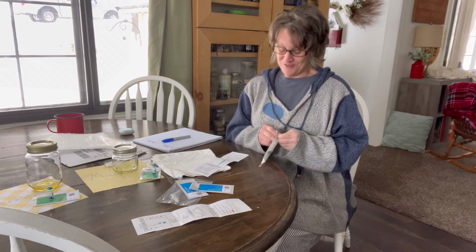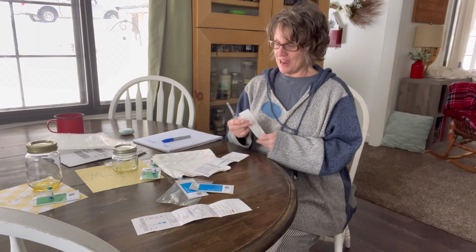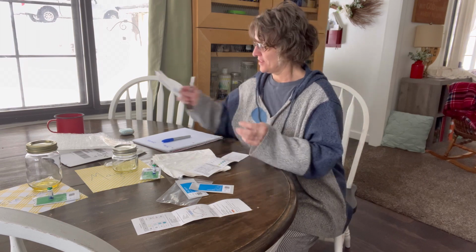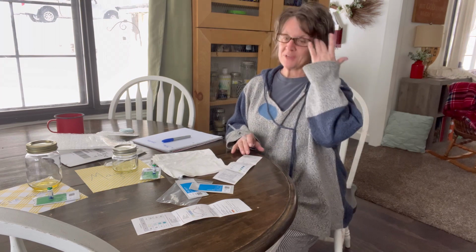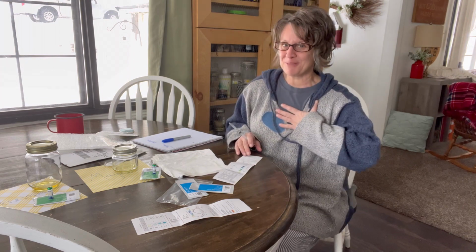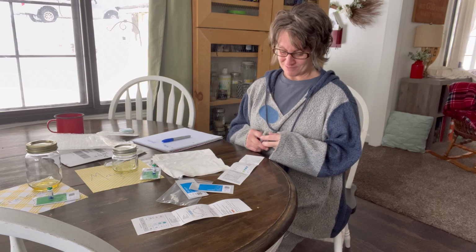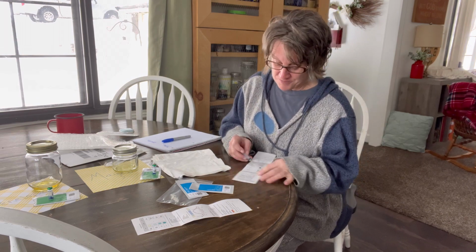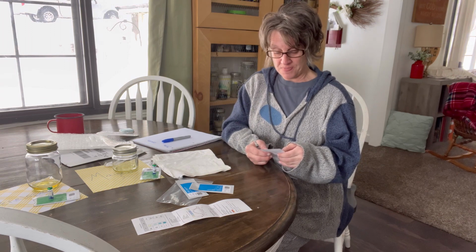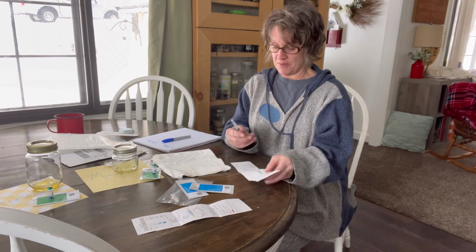You guys, I waited for this moment for so long. And to be honest, I'm a little terrified. I hope I am doing right by my ladies, because I love them so much. And they are such a huge part of my life now. I'm all emotional. Okay, so this says I need to pull up 2 to 5 milliliters. I don't even know if I've got that much in there.